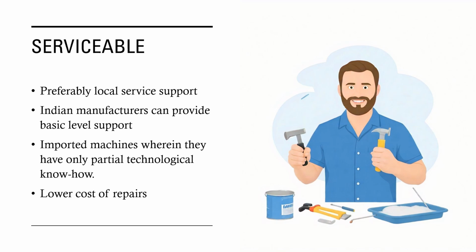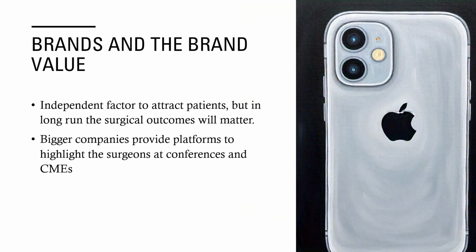With imported machines, engineers are trained at the facility where the machine is being built, which is usually outside India, and they give you only partial technological know-how. So their modules can be changed, the repairs are not basic levels. And as a result, the Indian companies will give you a lower cost of repairs. And this will matter once you have purchased a machine.